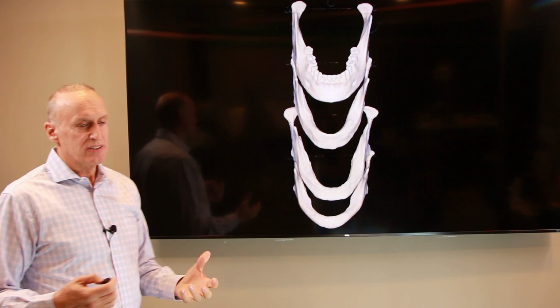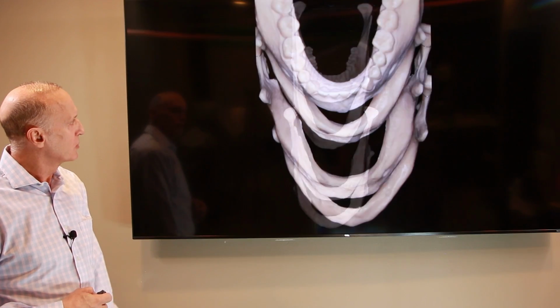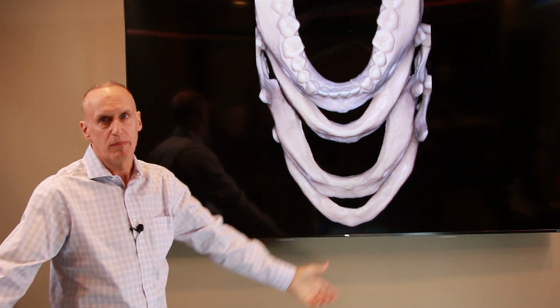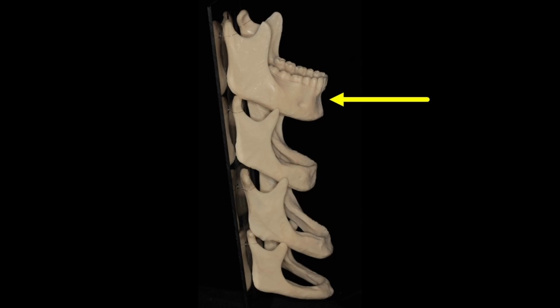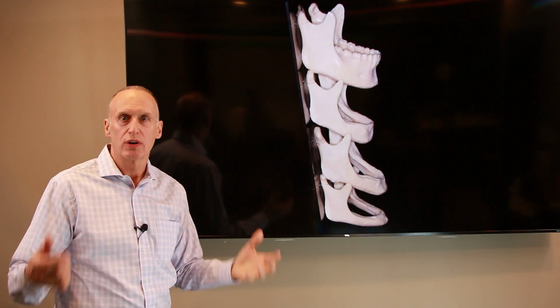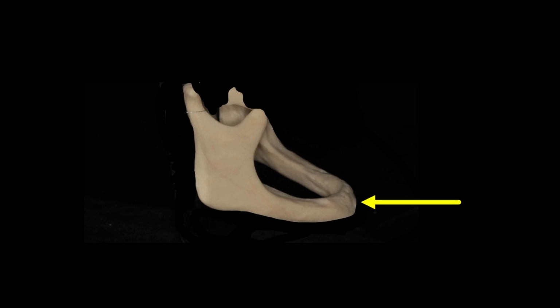The lower jaw is a little easier to show because of the way the model is set up. Here you are at 18, and let's just go through these. This is from the top view, and you can see the thickness reduces with each decade of bone loss. But this is probably the most profound picture that I took of this model. Look at how much bone there is here. It's reduced by maybe 30% here, 50% here, 80% here. So this patient, this is the person that All-On-4 was intended for. This is the person that the Brånemark treatment was intended for. And this only represents a very small percent of our population.